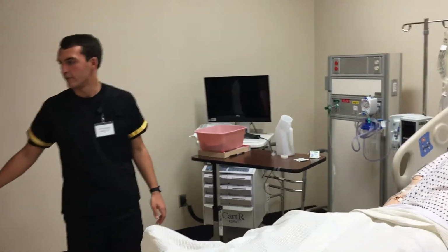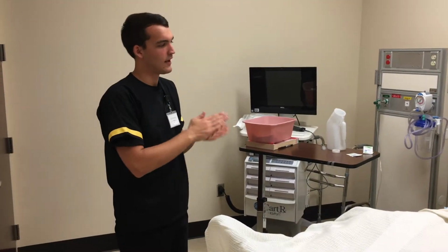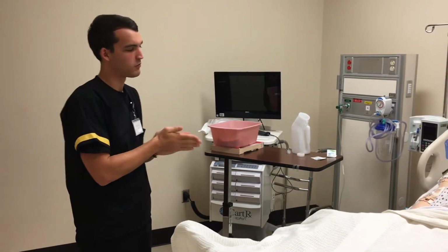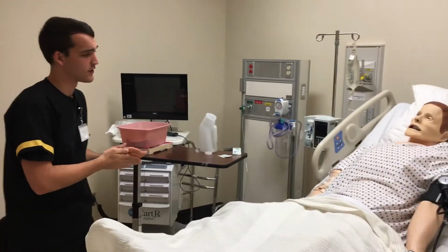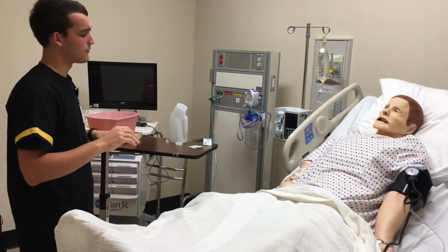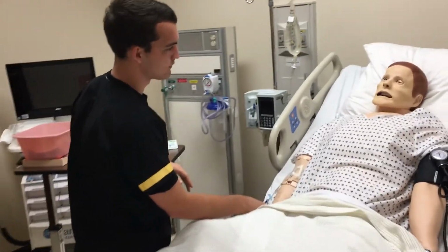I'm going to be your nurse for today. I have orders from the doctor to put in a urinary catheter tube. You've been retaining some fluids and your bladder's a bit distended, and I know that can be uncomfortable, so we're just going to try and insert this and alleviate you. So I've got to ask you to confirm your name and date of birth for me.